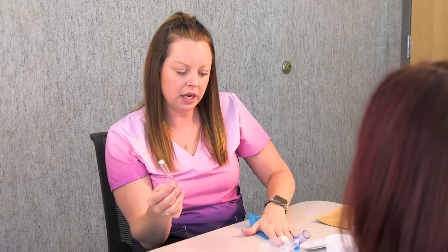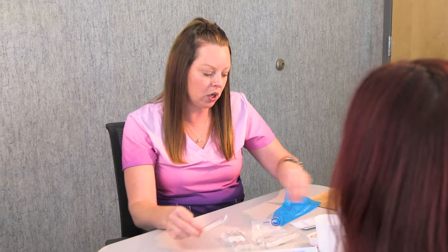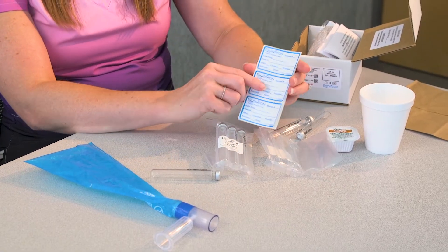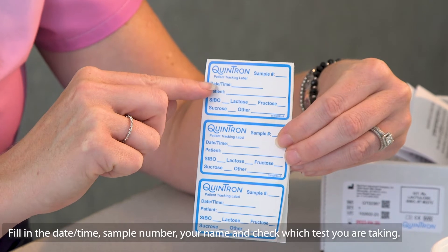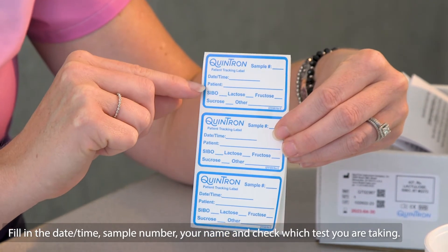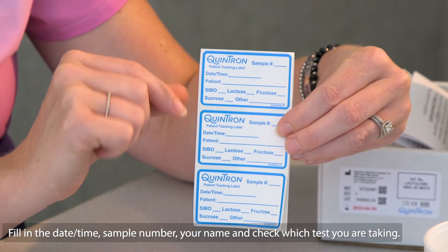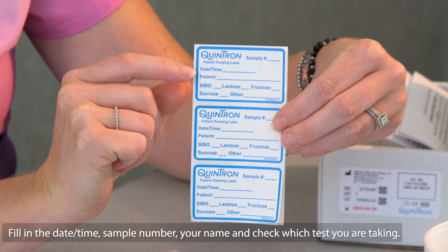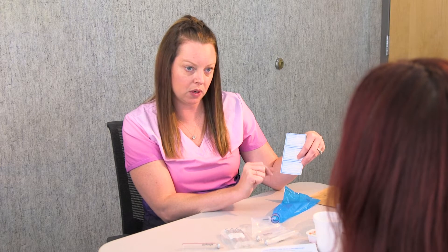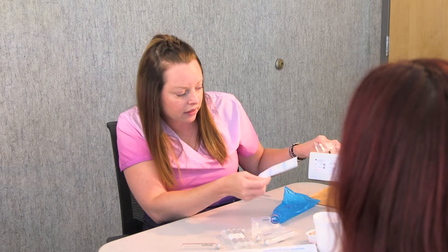After you blow into the tube, you're going to fill your label out. You will put the date, the time, and the sample number — so that will be sample one. Then you will put your name and the test name. This test is SIBO, so you'll mark the SIBO one. You can also find that on the box — it says SIBO on it.